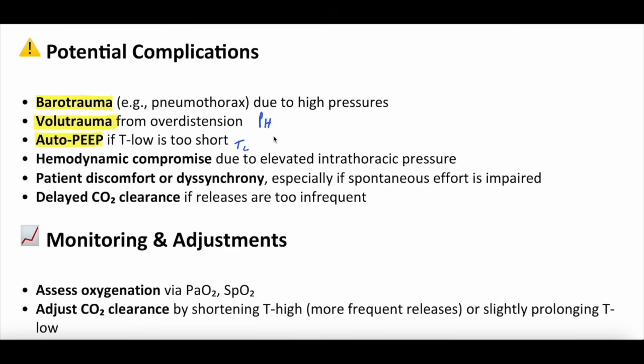But at the same time, you don't want them to fully exhale all their air when they're in T low because you don't want them to de-recruit. So you're trying to walk this fine line, which is why this can be a difficult modality for mechanical ventilation. People say those with really severe hemodynamic compromise may not do well with APRV because of elevated intrathoracic pressures. Again, this is maybe less of a thought, but definitely something to keep in the back of your head. Patient discomfort and desynchrony can happen in APRV just like anything else.